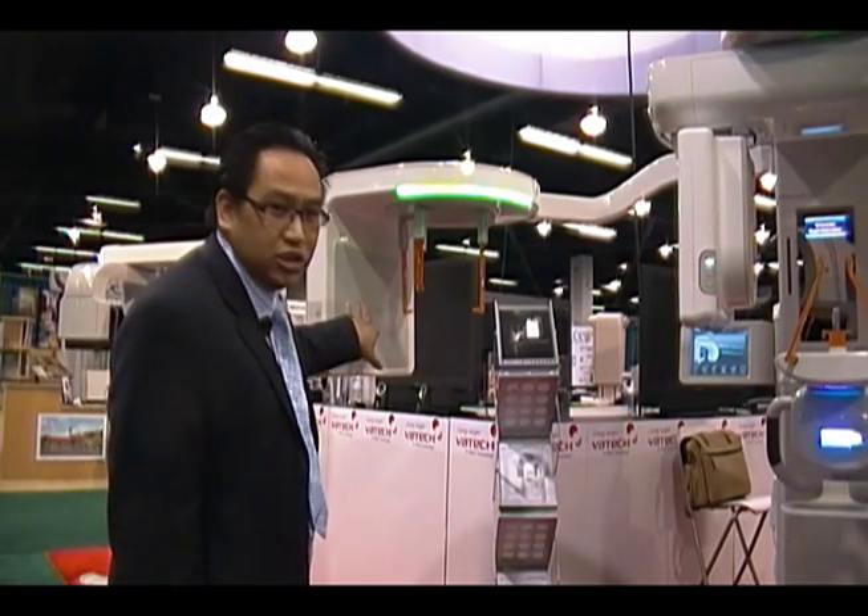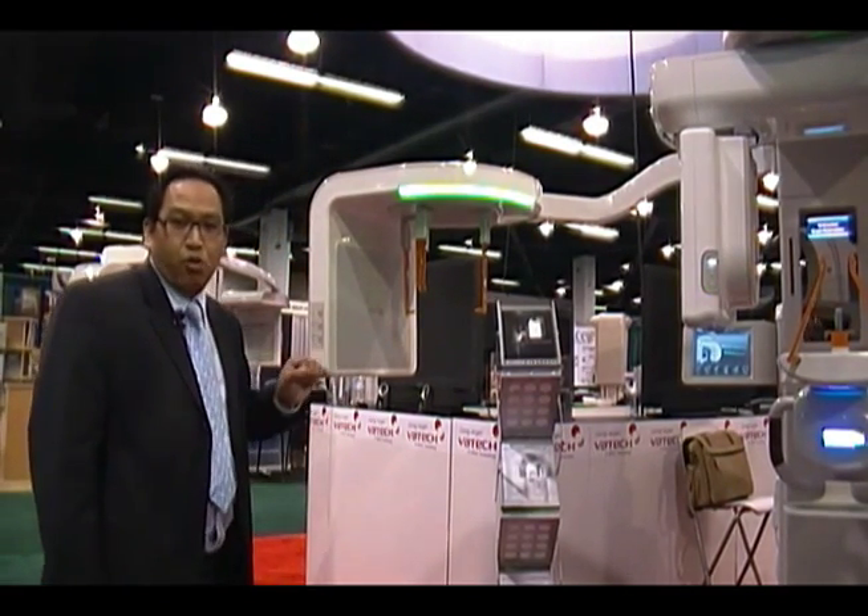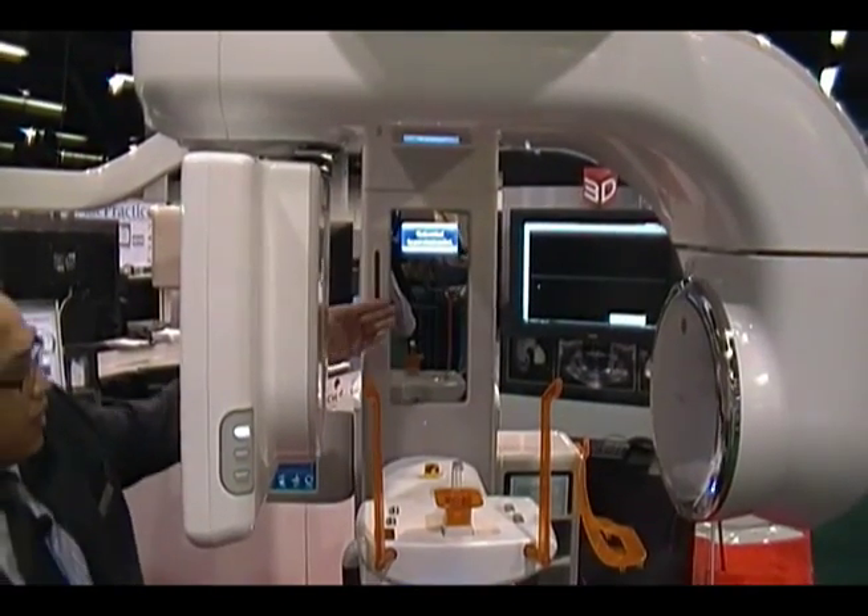On top of that, we're using our new sensor technology co-developed with Samsung, where we're able to capture a 9.4 megapixel image. Like our Pax Dual, we have the embedded camera in the mirror system for easy positioning. The camera system will display the image onto our touchpad display right here, so the staff member can position the patient very easily.